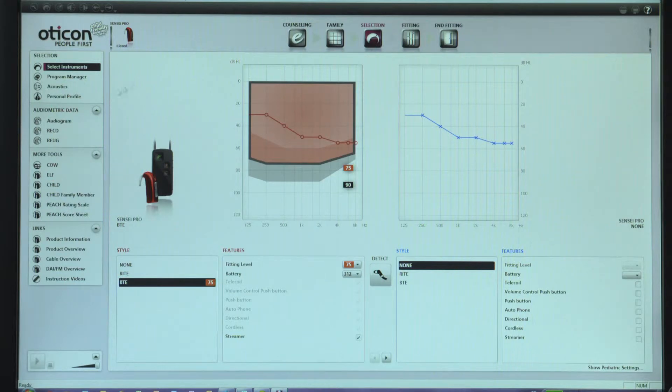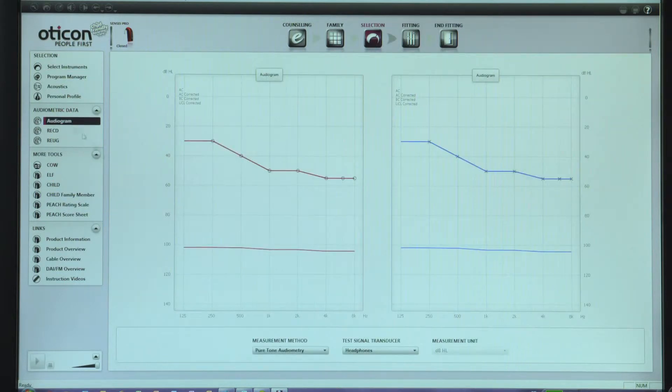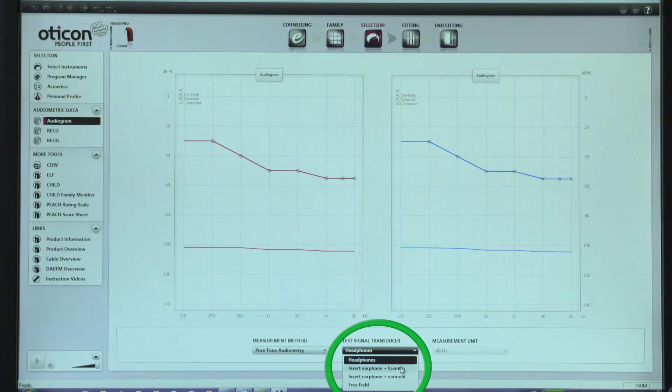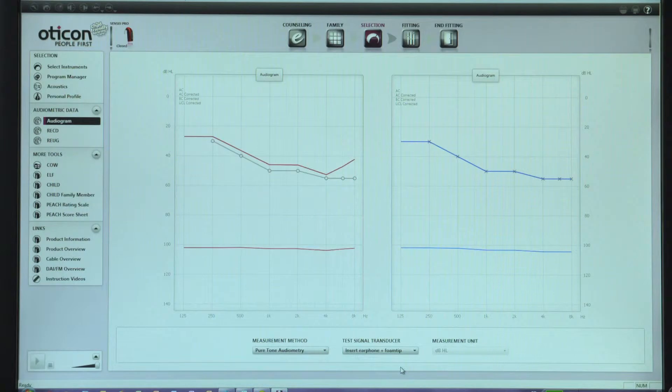Click on the audiogram screen in Gini and ensure that the choices selected reflect what was done during the audiometry. Also, ensure that the same transducers are selected in the Affinity software.